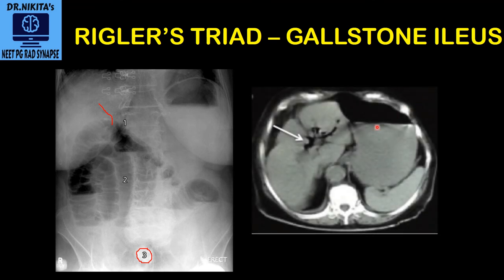Pneumobilia is very well seen on this CT scan. This is the liver, the organ on the right side. You see this air — we have seen that air looks black on X-ray and CT. You see this air in the biliary radicals, that is pneumobilia seen in gallstone ileus.